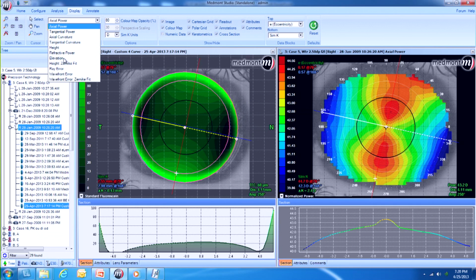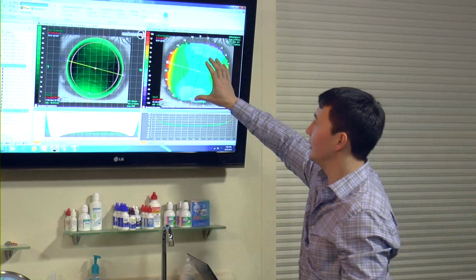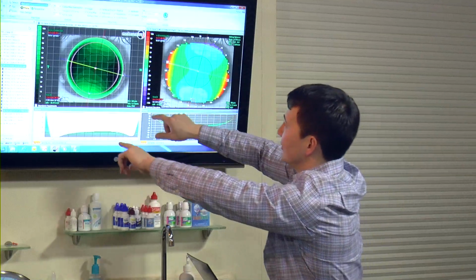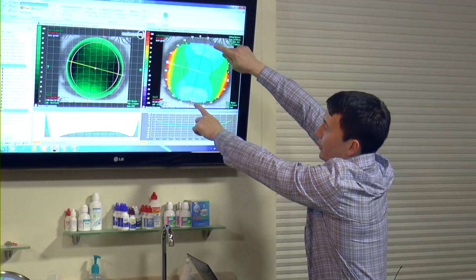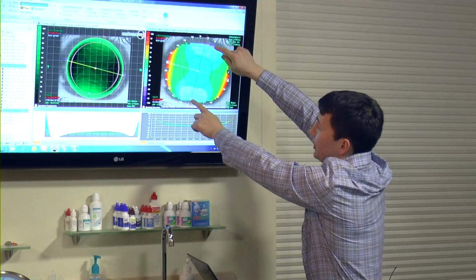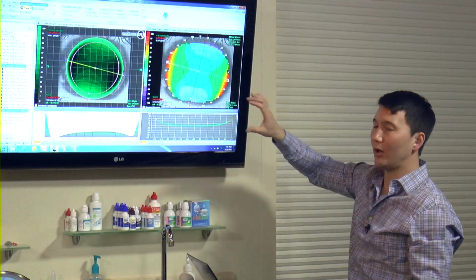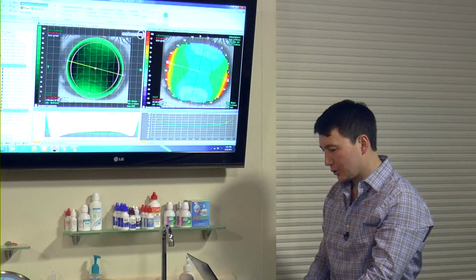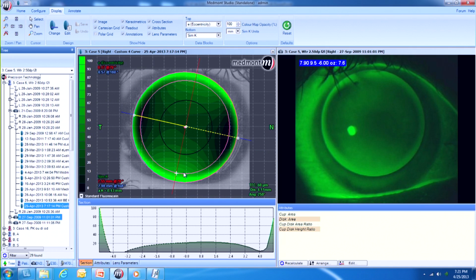Let's pull up the elevation map though. And notice what the elevation tells you and how identical this is to this, isn't it? Red, the cornea is high in elevation. Theoretical contact lens, points of bearing, same exact position. The map says blue, that's the eye depressing. The eye is dropping in elevation here and here, and that's what we're seeing in our contact lens, vaulting here and here. So really awesomely correlated, those two, the elevation map and the theoretical contact lens. So what if we were to take that lens that we designed and drop on the actual lens?